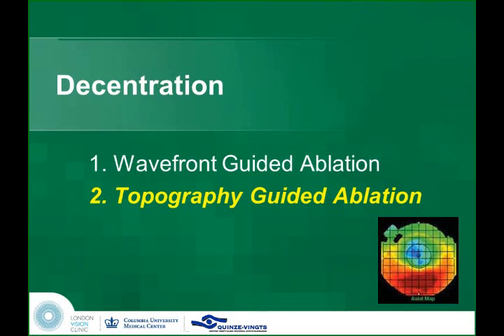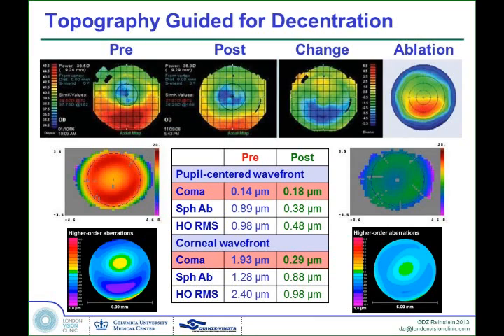So we decided to treat with the topography-guided ablation. And these are the results. So you can see the topography post-operatively, which is nicely centered on the vertex. And you can see that the change in corneal topography matches the ablation profile very well.